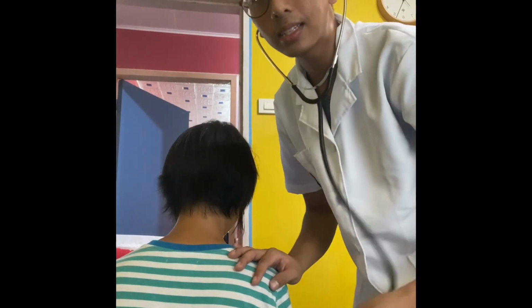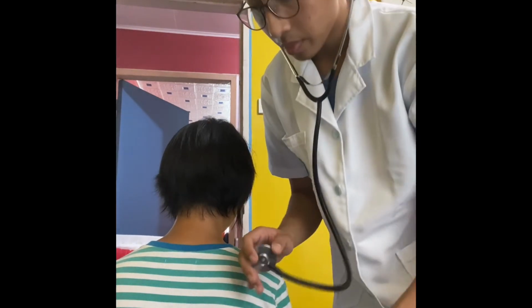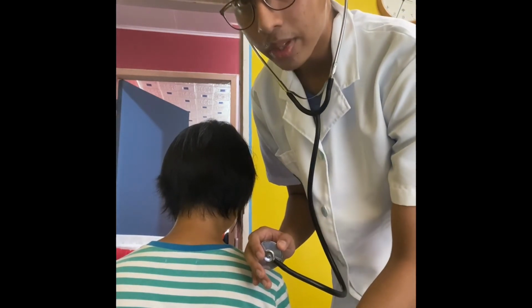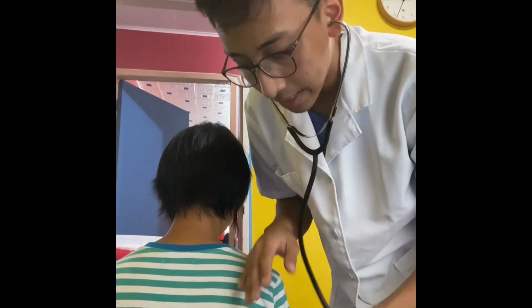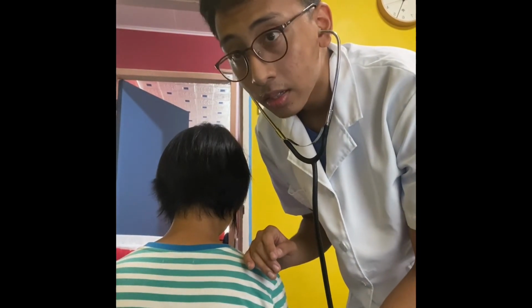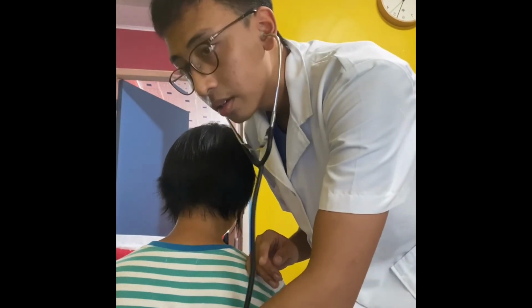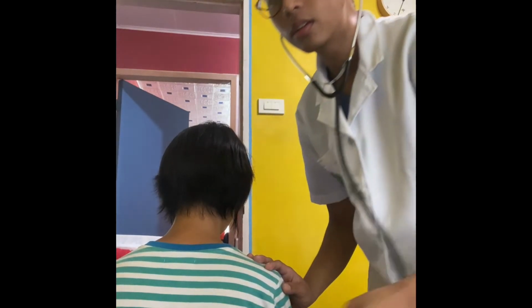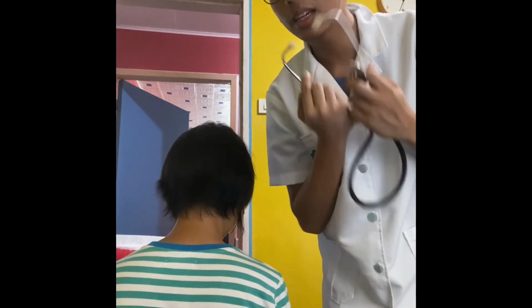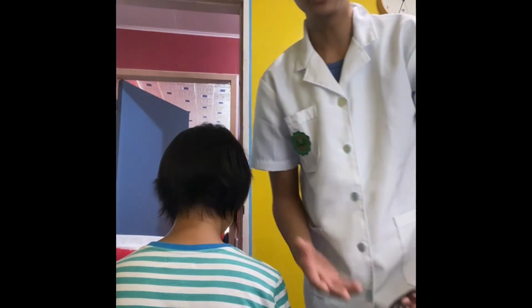Alright. So the last landmark is the lateral side of the 10th rib. So this is the inferior angle. Go a little bit down is the 10th rib. Then we go lateral to that. That is our last landmark. Inhale, exhale, miss. Alright. So what we just assessed is the lateral segment of the upper lobe. We just assessed the lateral segment of the lower lobe.